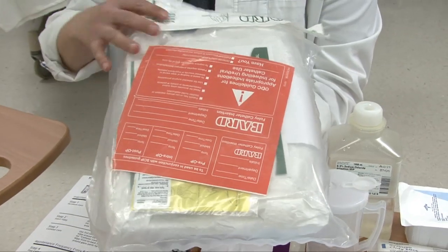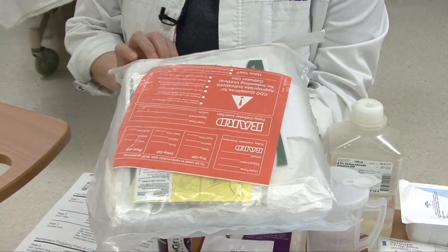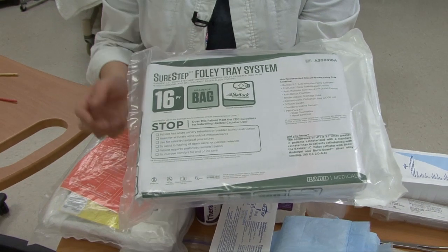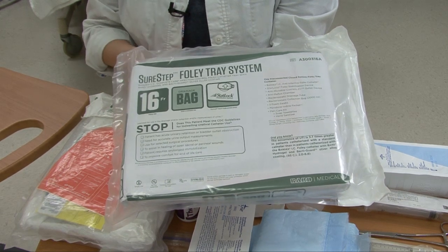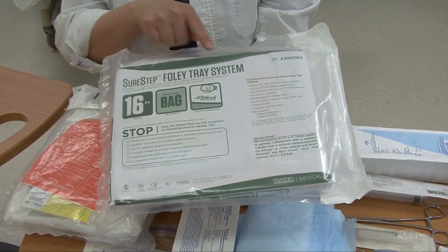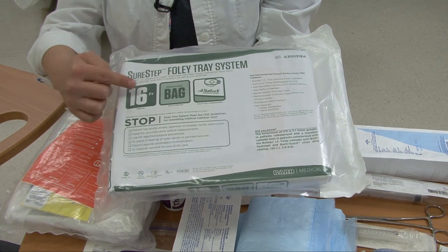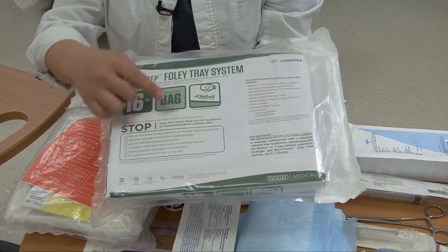Lastly on the tray is the Foley catheterization tray. Here is a closed, unopened SureStep Foley tray system. Very quickly on the package, you can see it is a 16 French, which is very commonly used for adult ladies and men. It's going to tell you that it has a drainage bag already attached — a 2000 milliliter drainage bag. It also tells you that it has a StatLock Foley stabilization device.